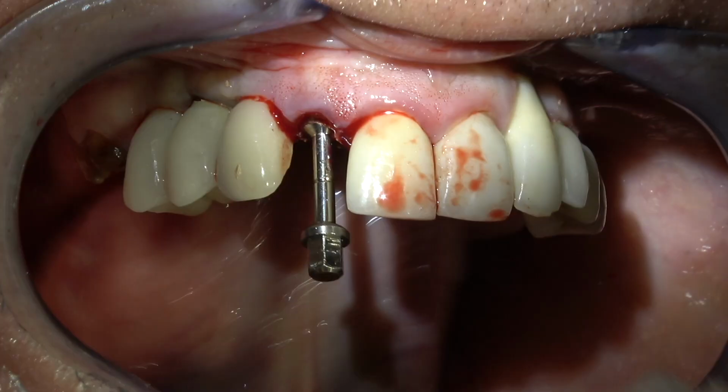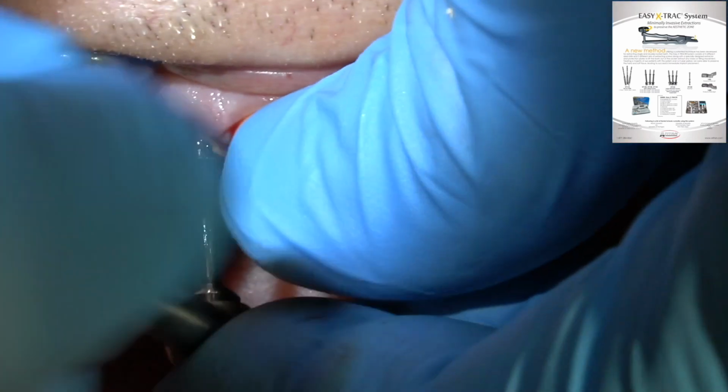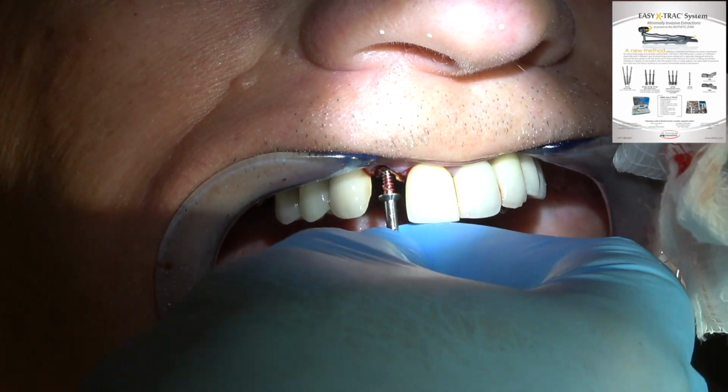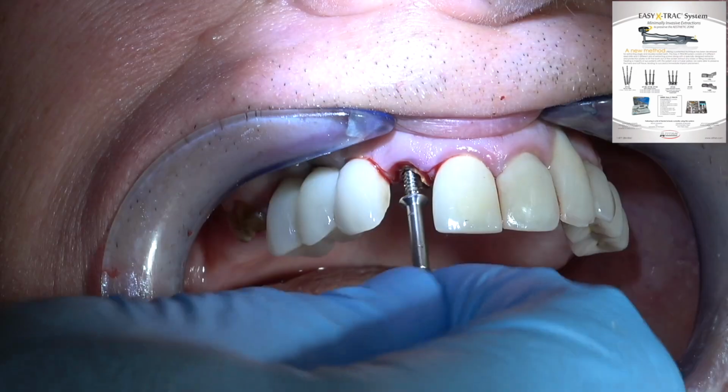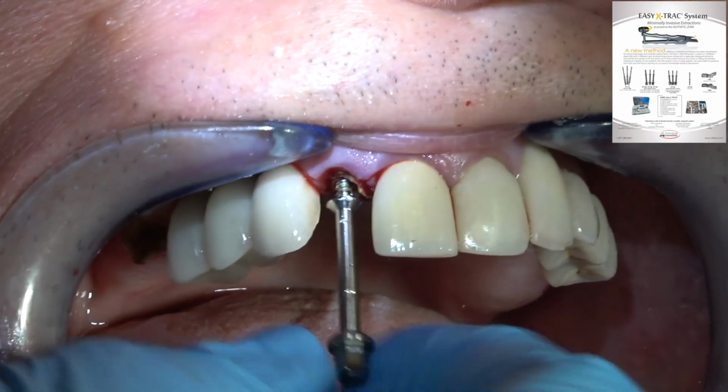Okay, so I felt like this screw was a little bit loose. It didn't bind as much as I wanted it to. So I went to the next width screw. I'm screwing this one out, and now I'm screwing the next width screw into the tooth. And I want it to bind at least when I use the ratchet wrench.